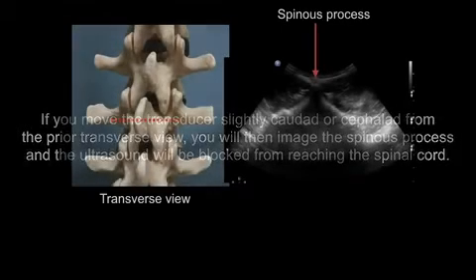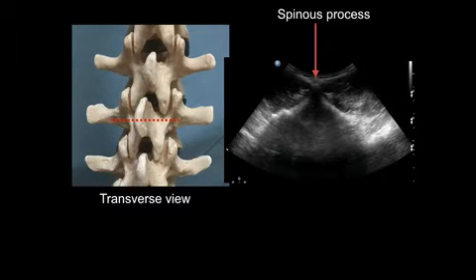If you move the transducer slightly caudad or cephalad from the prior transverse view, imaging through the facets, you will then image the spinous process, and the ultrasound will be blocked from reaching the spinal cord, generating a distinctive image. This concept is demonstrated here.